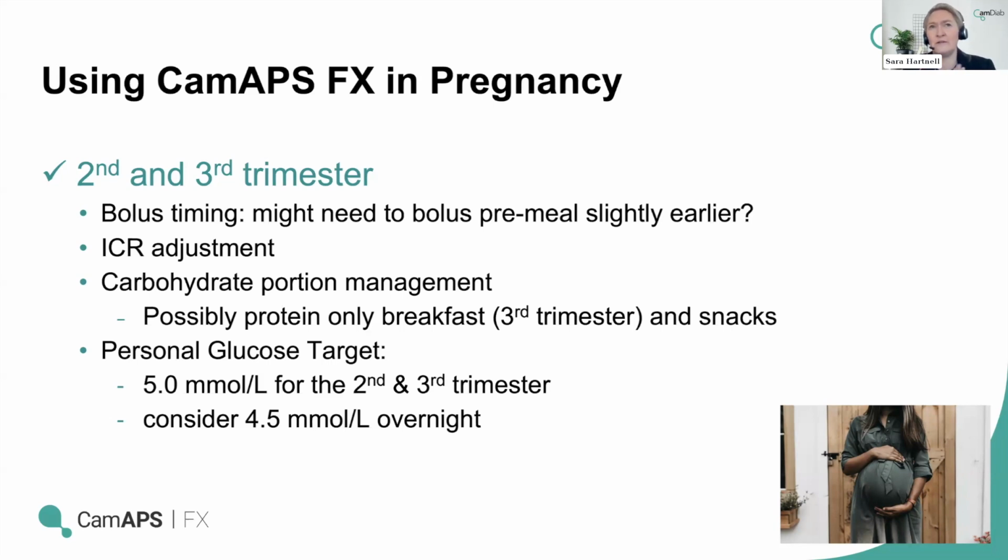Like we used to say, in the first trimester, 10 to 15 minutes, and the second, it might be 15 to 20 or even half an hour, and in third trimester, even longer than that. For most women, we didn't feel the need to do that in the studies, but obviously everyone's individual. And if you're seeing the need to, some people might need to move it slightly earlier. Adjusting those insulin carb ratios as the insulin requirements creep up, you'll be doing that as you're looking at the data regularly in any case.